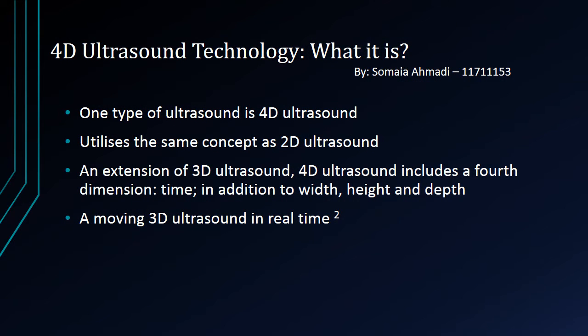When most of us hear the word 4D, we wonder what it might be. After all, we are familiar with 3D and 2D. Simply put, 4D introduces a fourth dimension besides length, width, and height. Time is the fourth dimension, which allows a subject to be viewed in real time. The same definition applies to 4D ultrasound. It allows us to view organs, or a fetus in this example, in 3D while it's moving and in real time.